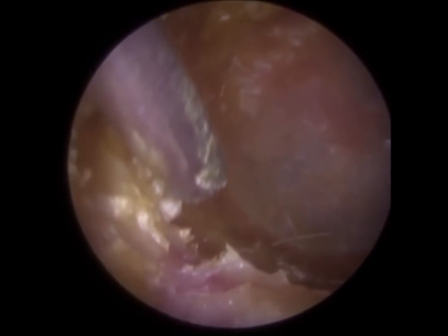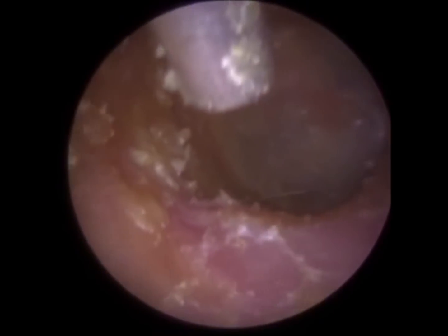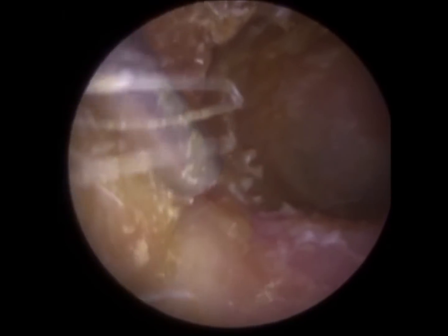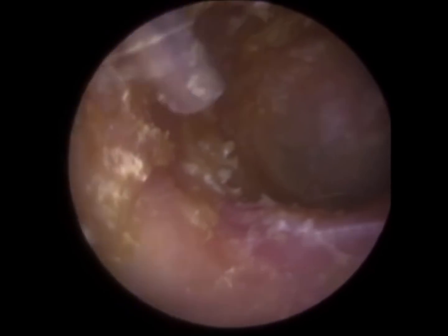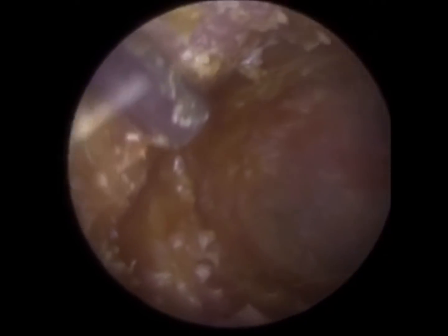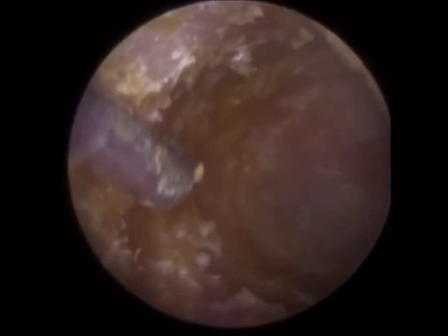You will get some bruising, some blistering, and sometimes that happens. It doesn't matter how skilled you are, how much of a steady hand you are. Sometimes, so just to explain what I was saying earlier, now we're on the outer part of the ear canal, the cartilage part, and you see there I was making contact like I am here. And that's because that's fine.